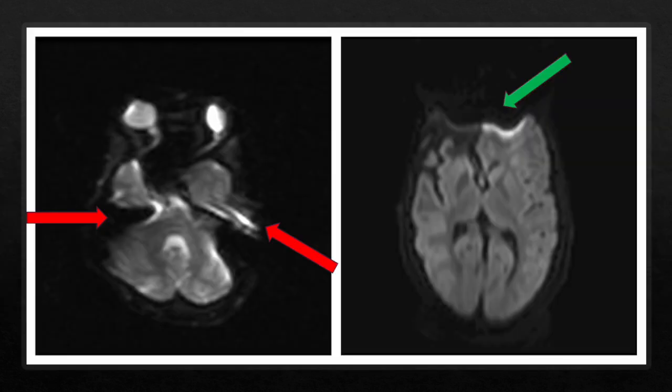And finally, this is a DTI artifact. I'm not sure how many centres regularly do DTIs. We do them quite often for epilepsy and sometimes for tumour imaging. So again, this is a bit like the air interface problem we had with the diffusion scan from earlier. This is susceptibility artifact that arises from the boundary between the tissue and air in the sinuses, a bit like before, like I said. They have different magnetic susceptibilities which affect the local magnetic field which causes the distortion.